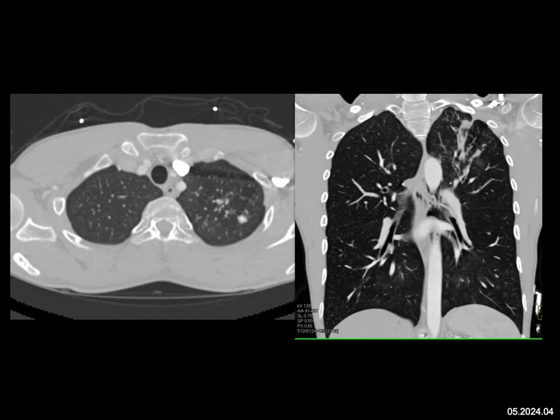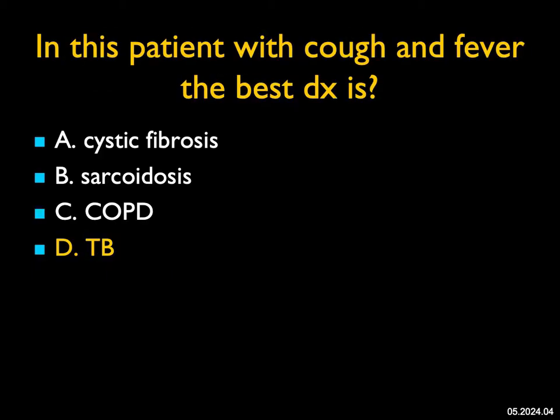This is not the look of COPD. This is more the look of an infectious etiology, and the only choice is TB. TB is more common in the upper lungs, can be nodular, and can cause bronchial dilatation and inflammation. The best diagnosis in this case is tuberculosis.